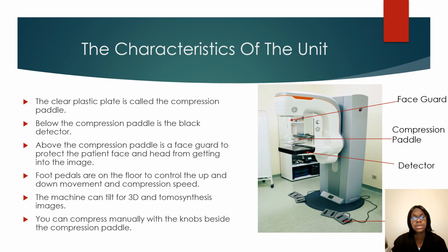I've had a patient in a wheelchair before, and we had to move the face guard back just a little bit because the patient wasn't able to lean in. When we moved that face guard to see how much breast tissue the patient could get on the detector, the patient's head was in the image or was starting to get in the image. So that face guard is wonderful. If you have a patient that's struggling, maybe they can turn their head a certain way and then lean in a little bit more. But the face guard is needed because it protects against any artifact getting in the image.